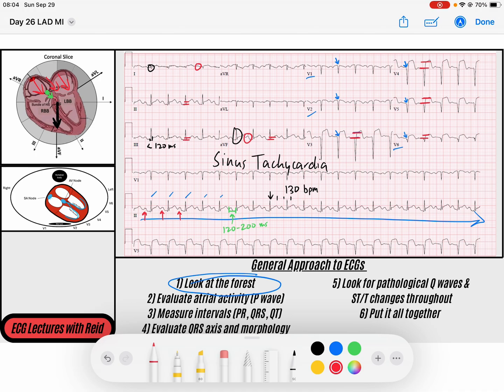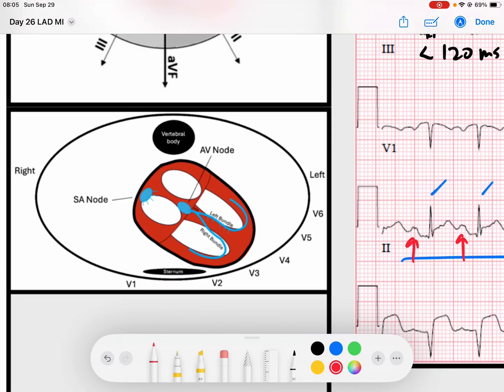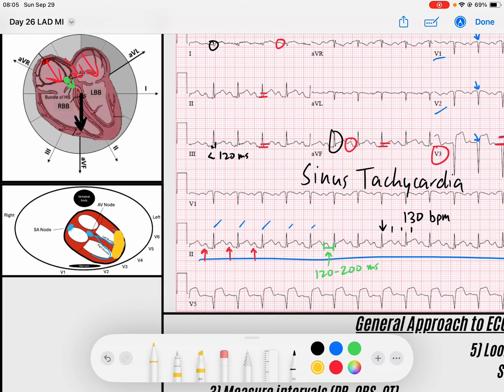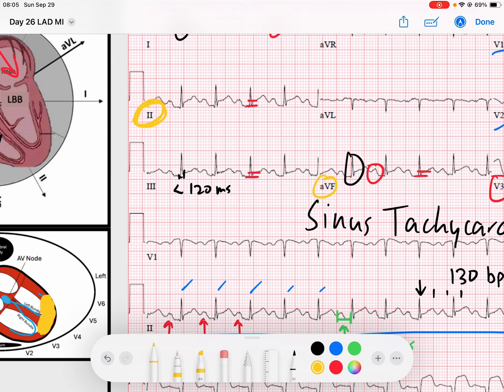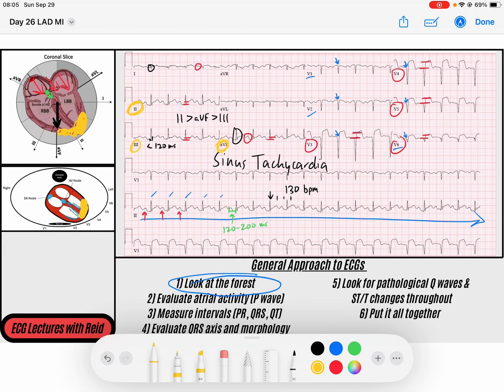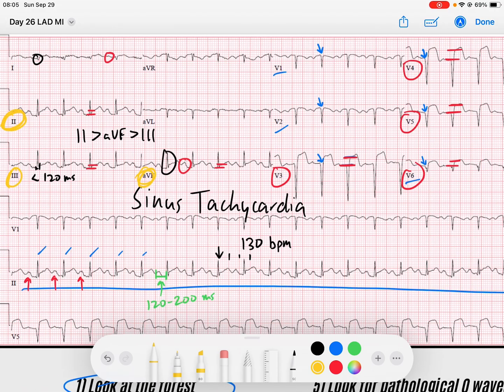We're seeing ST segments elevated in V3 through V5 mostly, and a little bit in V6. Looking at the transverse plane, we're getting ischemic changes in the anterior wall, a little bit to the lateral wall. And then we see it in lead II greater than AVF greater than III, so inferior — kind of the apical region. Predominantly an anterior wall STEMI with some extension to the inferior.